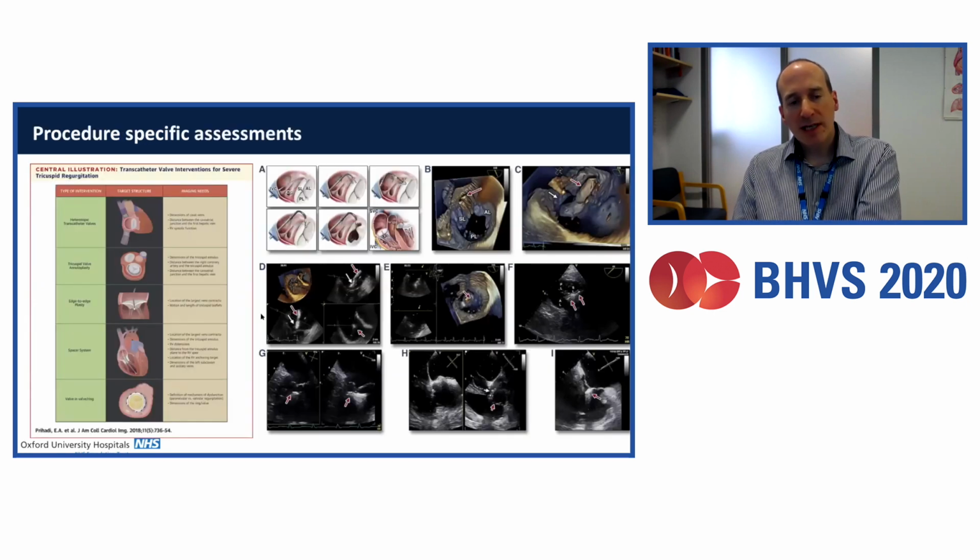Further measurements really are going to be dictated by the treatment you may be involved in assessing the patient for, and the new devices and therapies that are being developed will have their own unique set of measurements you may be required to take, and you've got to liaise closely with your research and interventional colleagues to provide a data set that works for them.